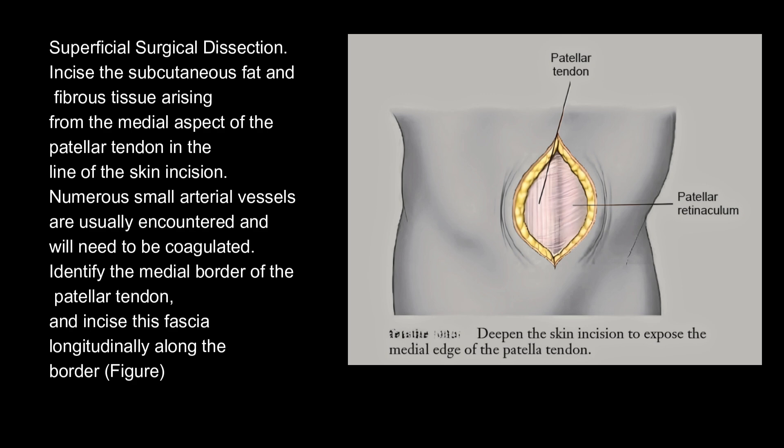Superficial surgical dissection: incise the subcutaneous fat and fibrous tissue arising from the medial aspect of the patella tendon in the line of the skin incision. Numerous small arterial vessels are usually encountered and will need to be coagulated. Identify the medial border of the patella tendon and incise this fascia longitudinally along the border.